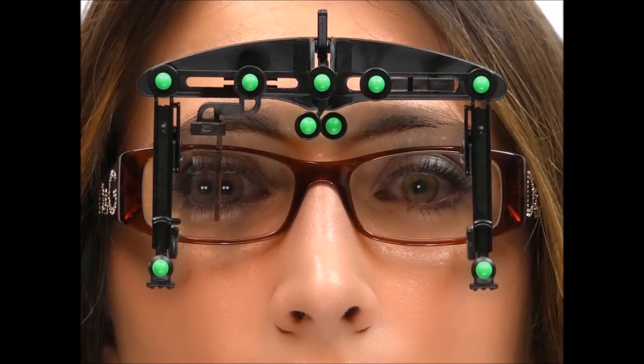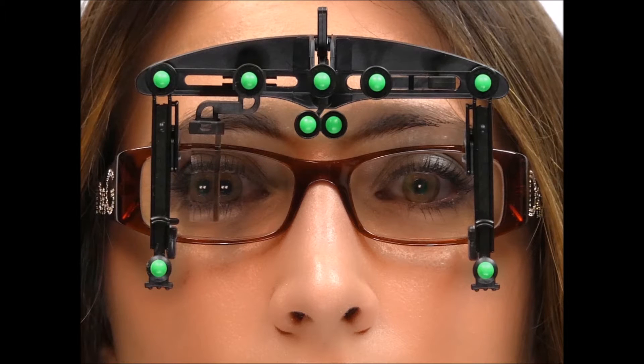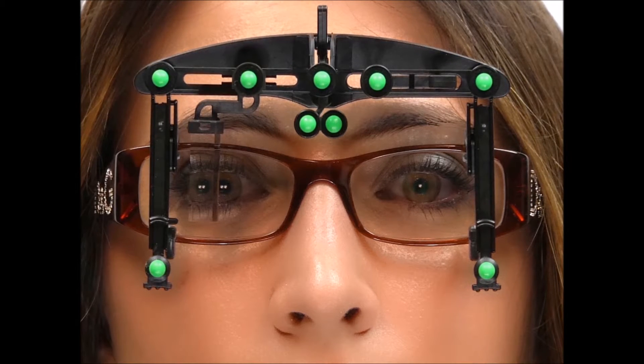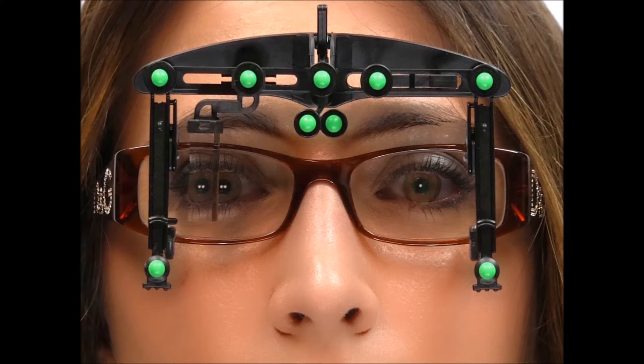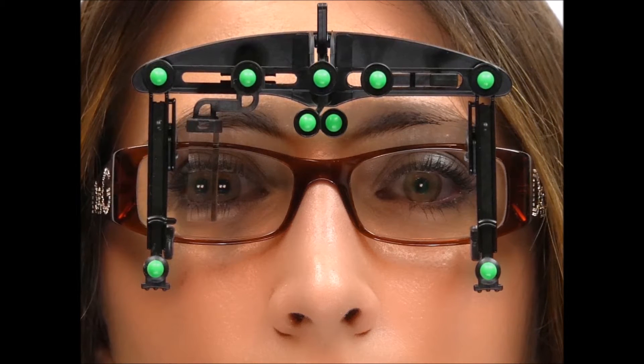The EY Stick is the device used to capture all the advanced optical eyewear measurements using one single frontal image.